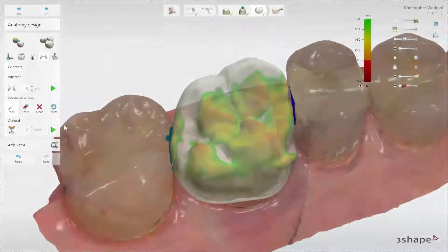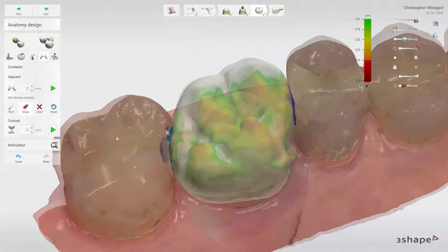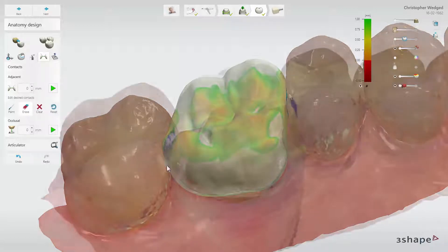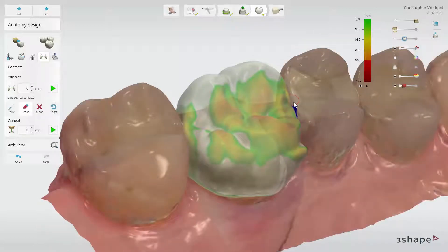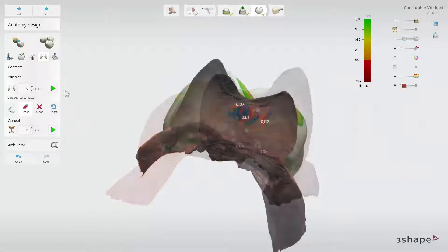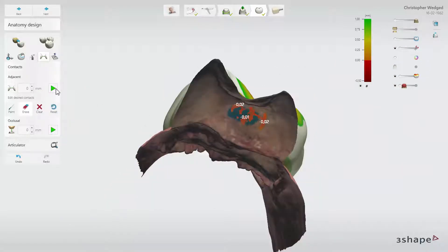You can use the Erase tool to decrease the range and change the shape of the contact surface. When the value and shape are set, click the Play button to apply it.